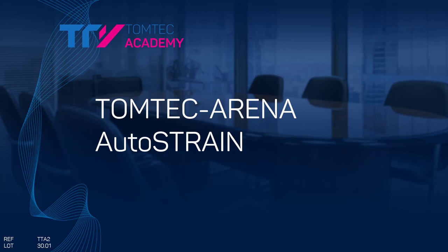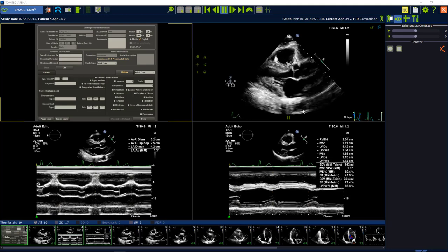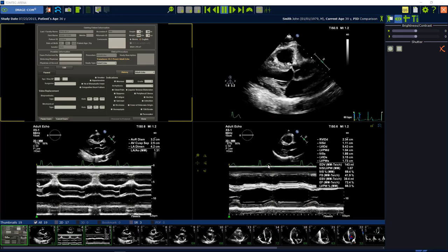Welcome to our AutoStrain tutorial. AutoStrain performs an automatic three-plane strain analysis of the entire left ventricle.